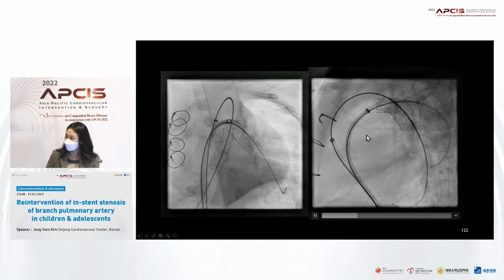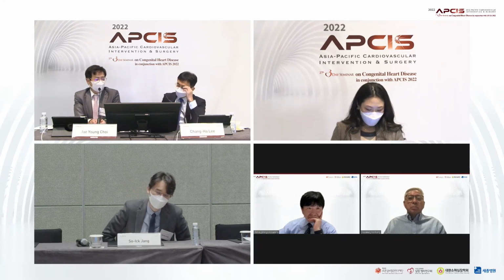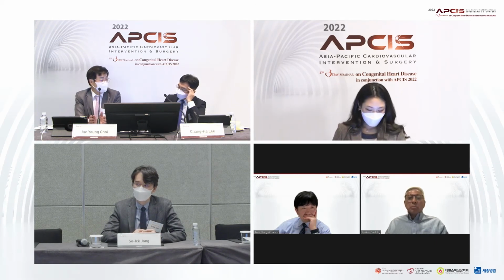Professor Che? Yeah, my comment is that this is not the V-stent technique, not the kissing technique. It is in between the V-stent technique and the Y-stent, the kissing technique. I would prefer the kissing technique in this patient. And reciprocal crushing of the opposite side stent is the rule when you are doing this kind of procedure.